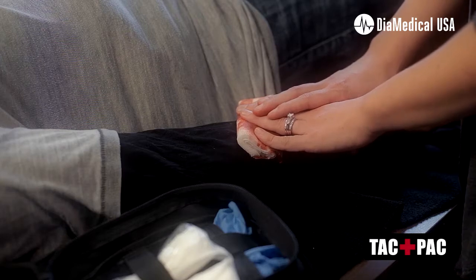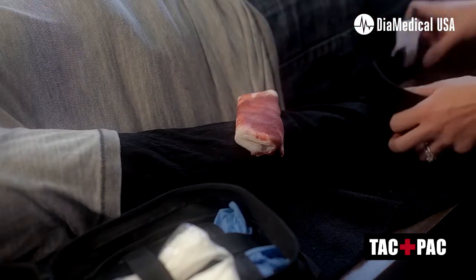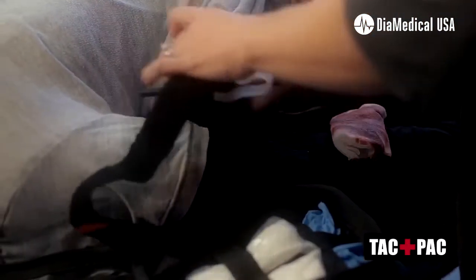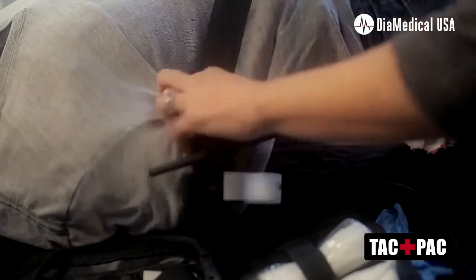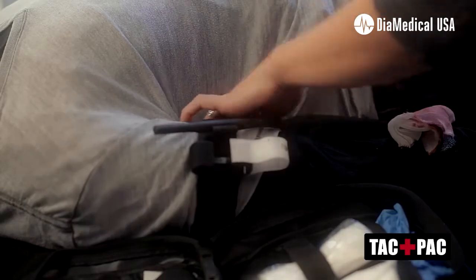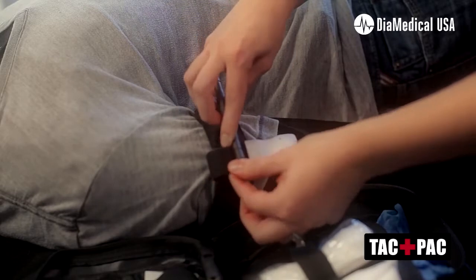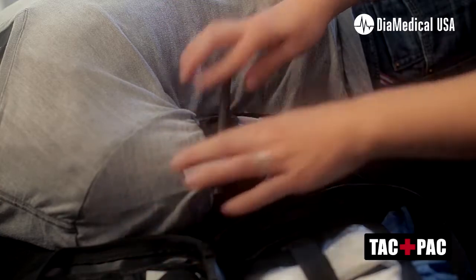If the bleeding continues, next you'll reach for your tourniquet. To apply the tourniquet, you slide it over the arm, above the wound, grab the red tab, and pull snugly. Turn the windlass until the bleeding stops. Lock it into place, and apply the cover.